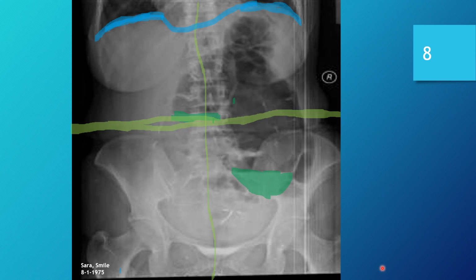Now, moving on to number 4, is the image free from artifacts? I think this is potentially also what might be playing into the quality of this image. We have some definite artifacts located here on the presumed right side of the screen. I'm sure you saw those right away.